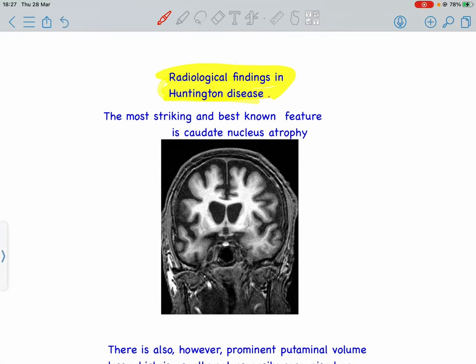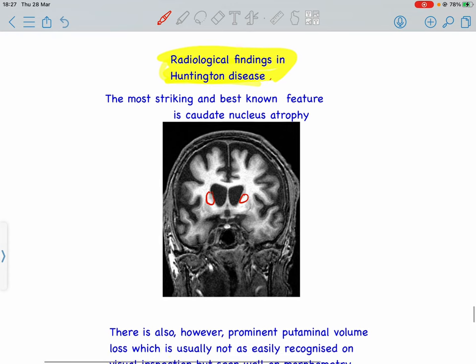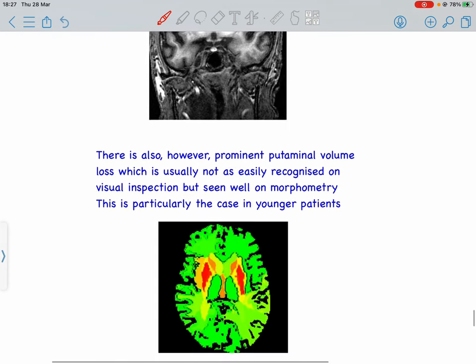Radiological findings in Huntington's disease: the most striking and best known feature is caudate nucleus atrophy. This can be appreciated in the MRI, showing bilateral caudate nucleus atrophy, which can also be seen on morphometry.